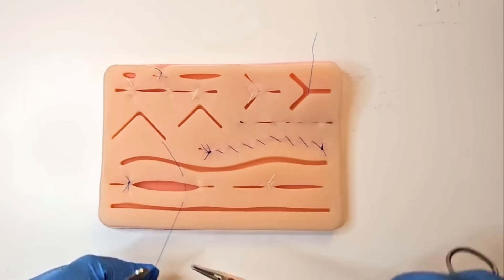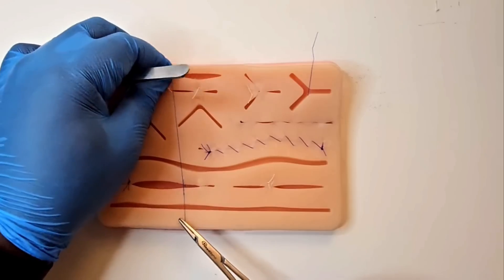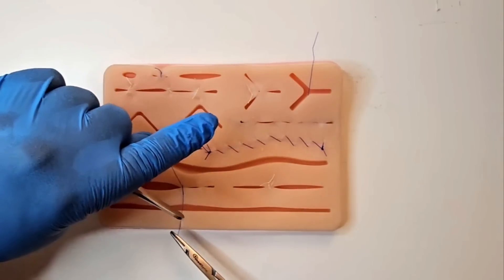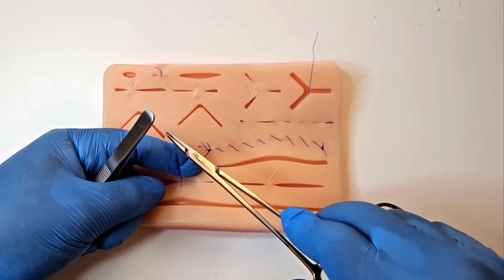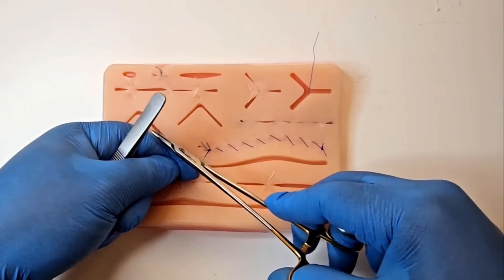You tie your standard surgeon's knot. Keep the tension on the short suture and sweep your index finger under the long suture. Place the short suture on top like a cross and press down on the junction between the two.